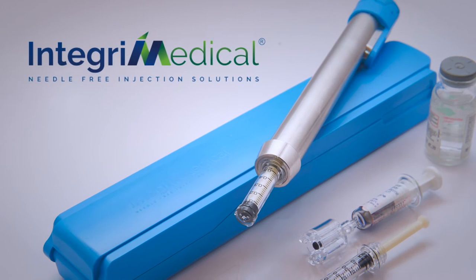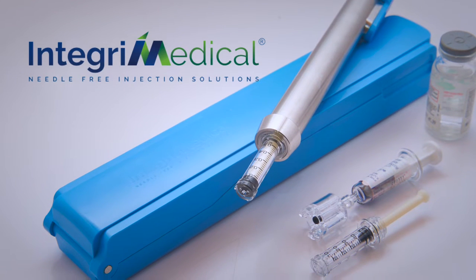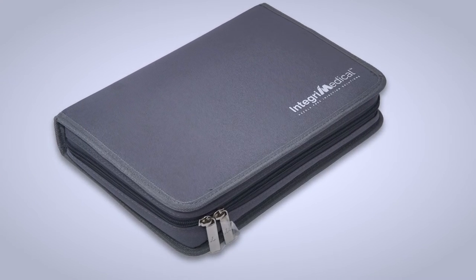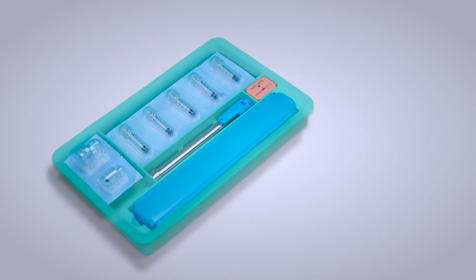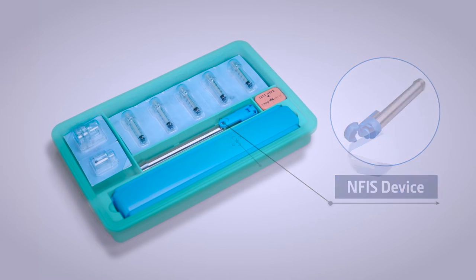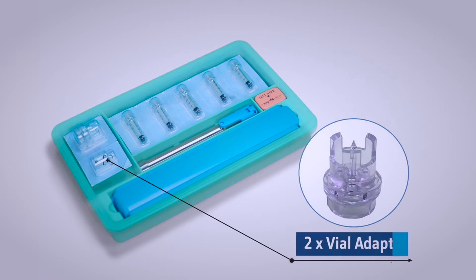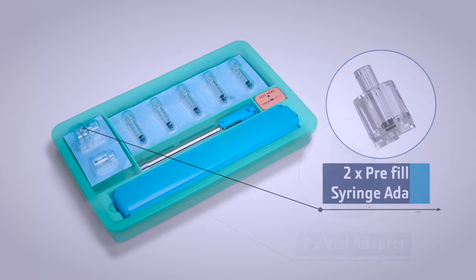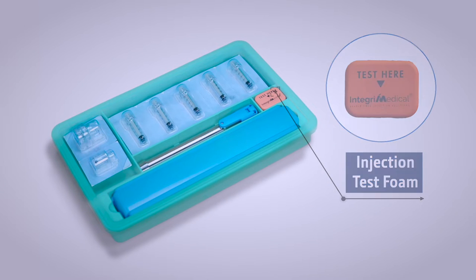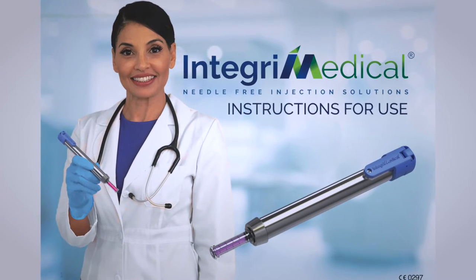Welcome to Integri Medical's Needle-Free Injection System. The Integri Medical kit comes in a sleek zipper bag. It contains the NFIS device, a loader, disposable cartridges, vial adapters, pre-filled syringe adapters, a testing foam, and an instructions for use manual that has all the information included in this demo video.